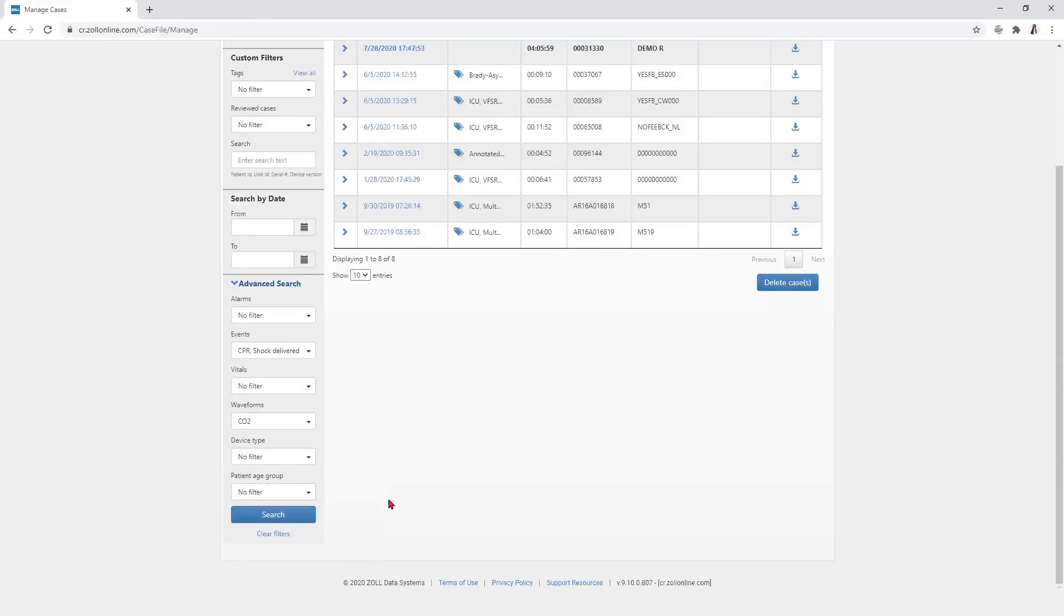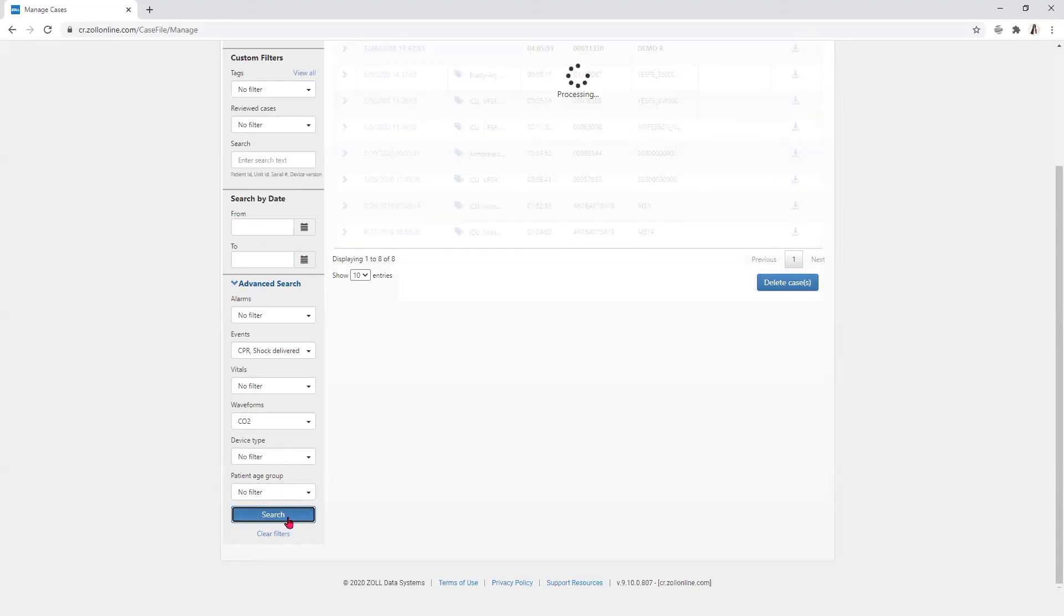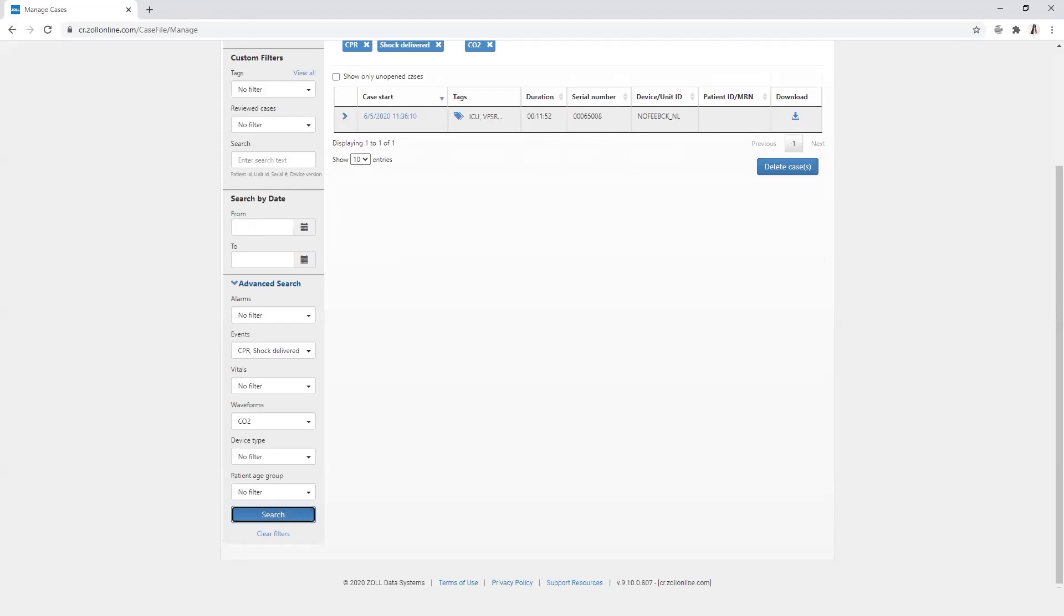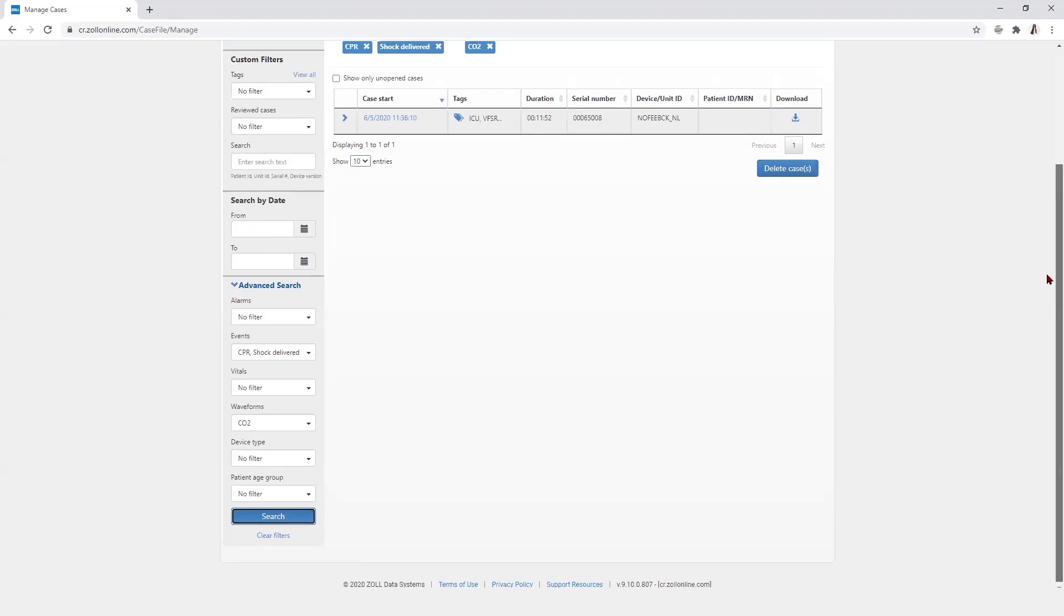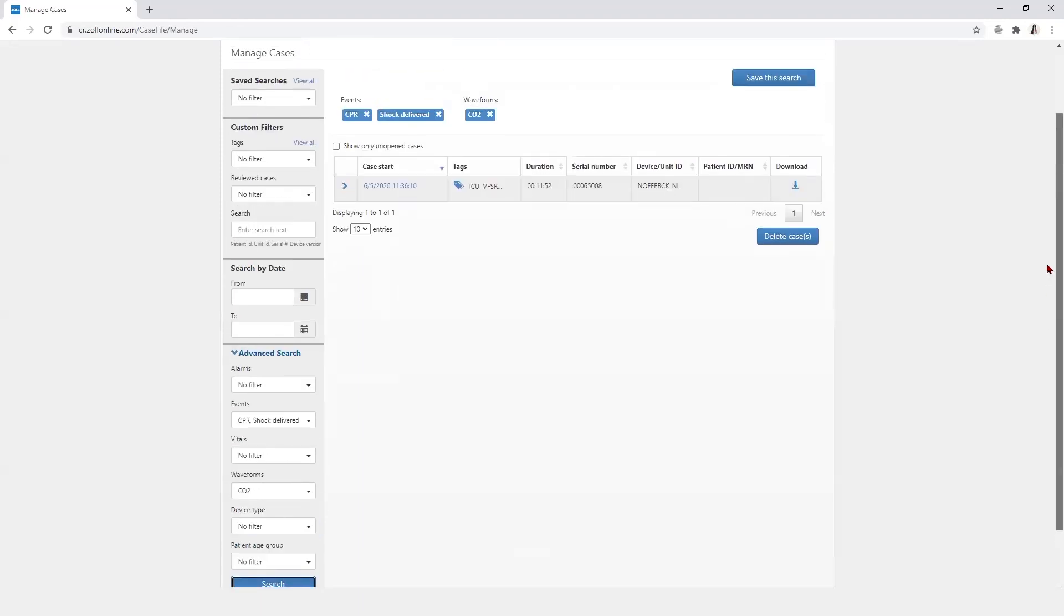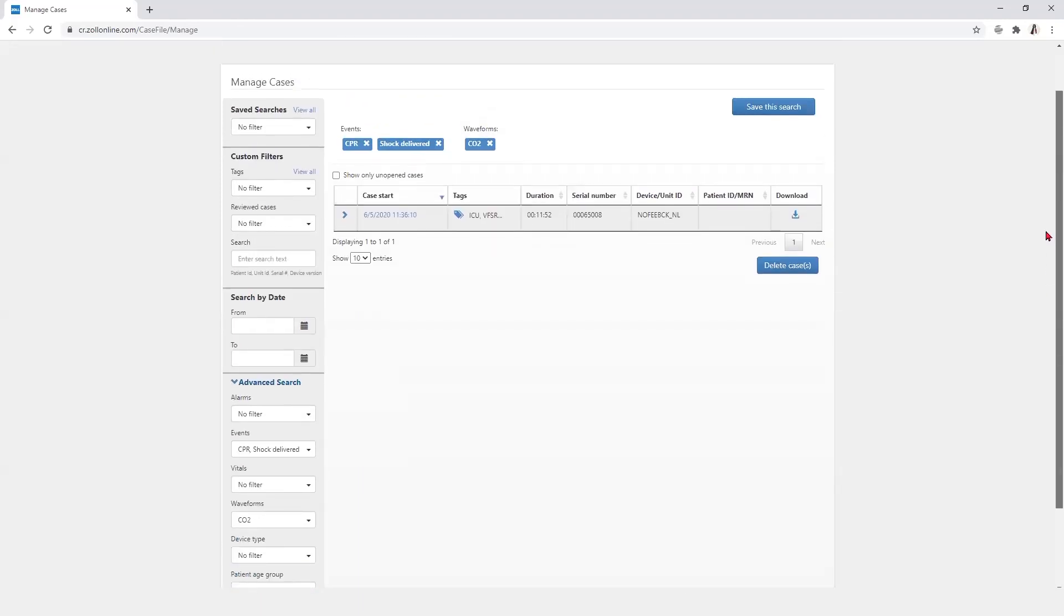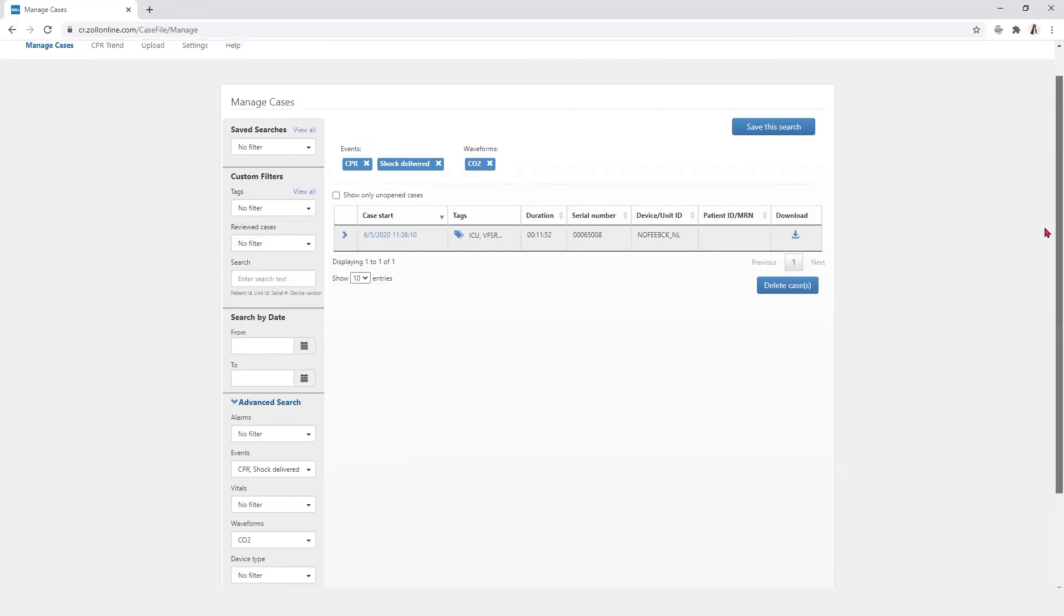With the exception of the device type, the search includes all cases that meet that particular search criteria. Cases that match some but not all of the checked criteria will not be displayed. This search can also be saved using the save search feature and selecting the blue button to the top right of the page.